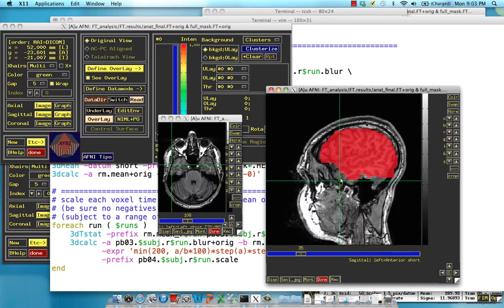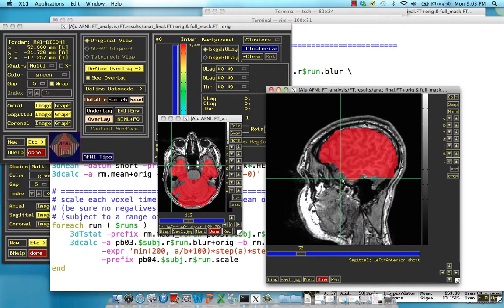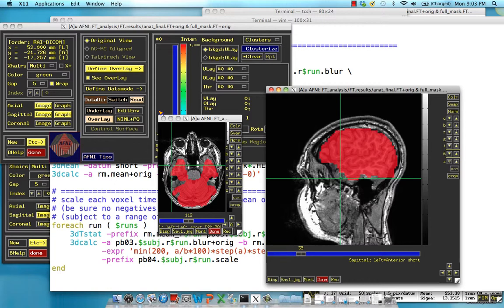So what happens, you can dilate it more if you want, but it can also lead to more false positives. Okay. So that's 3D AutoMask. And in the next section, we'll cover the scaling, which is the last preprocessing step before running our model.